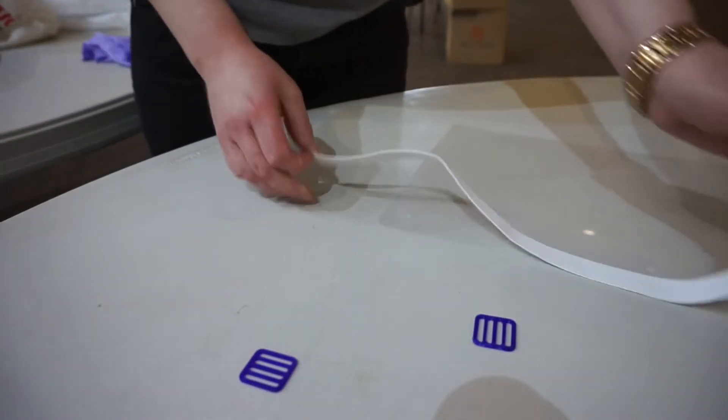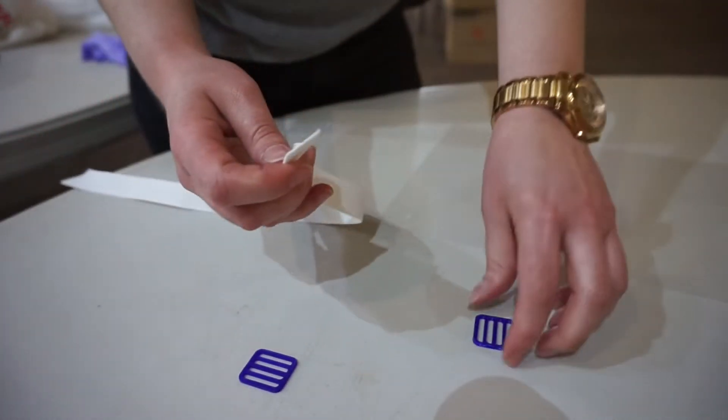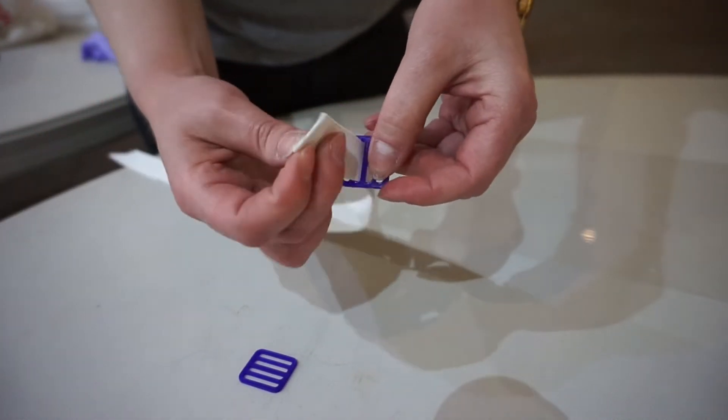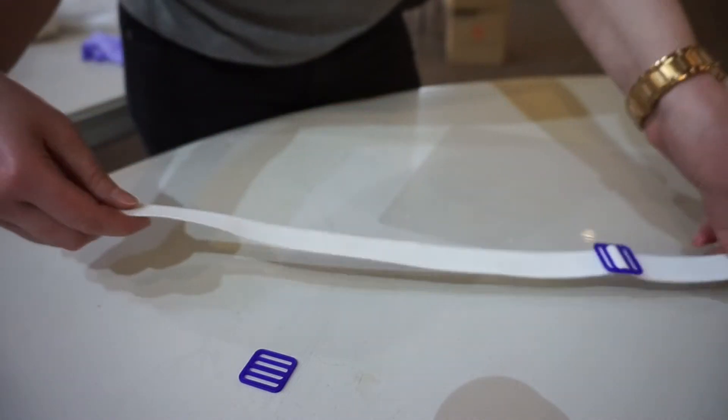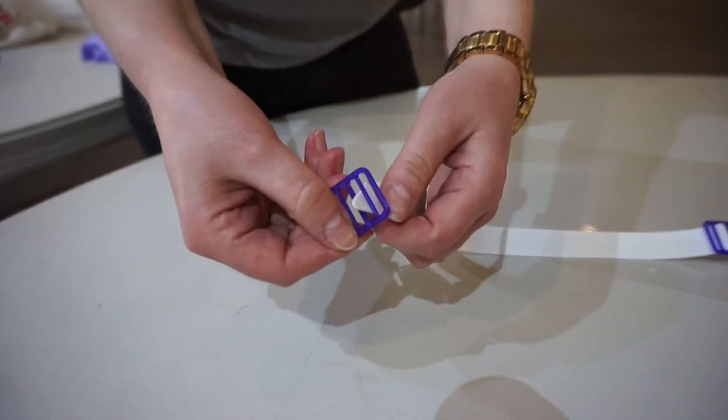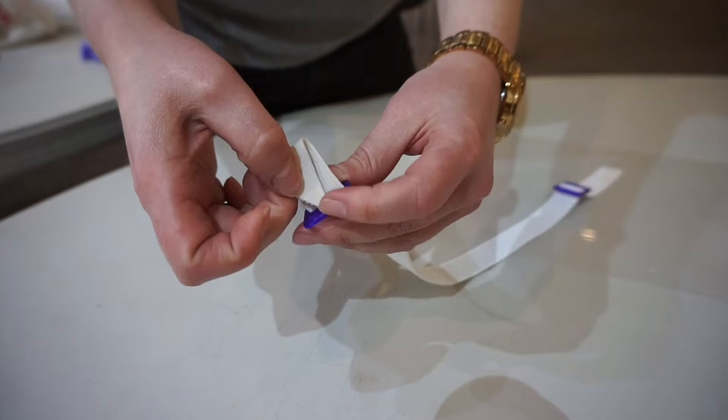Take your piece of elastic and the strap locks. It will go first through the inner two holes. Cutting the elastic at an angle can help with assembly. Do this on both sides.